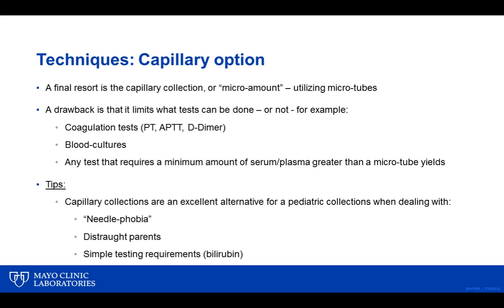Capillary as an option. It really should be a final resort because, as you know, we don't typically get great results. Those of you that have done a lot of capillary collections, I know you get frustrated with the EDTA tube coming back as clotted, and we ask ourselves why. The blood flowed well, and a lot of it relates to the volume of blood in the tube, how quickly we get that tube inverted.